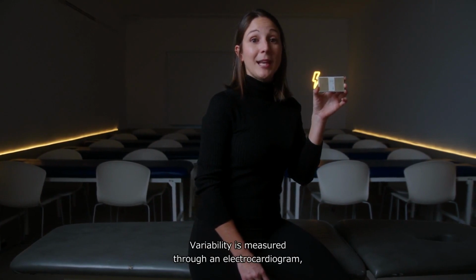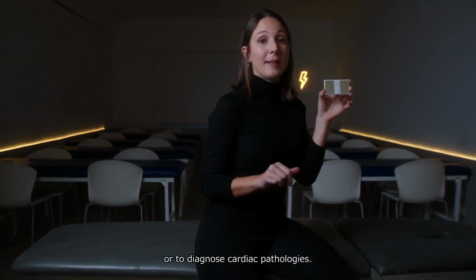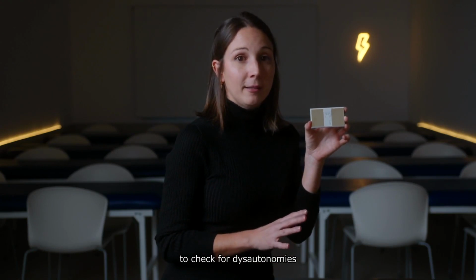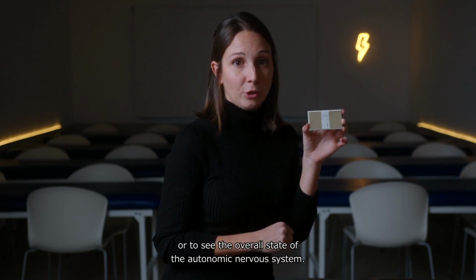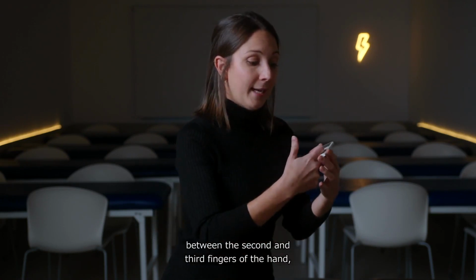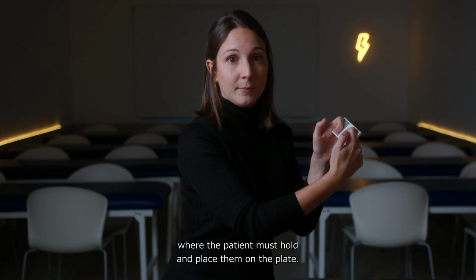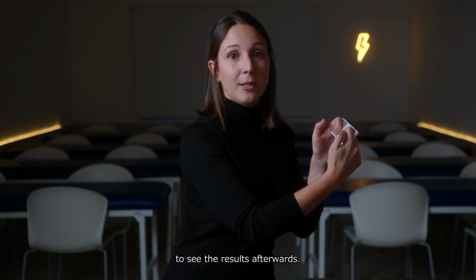Variability is measured through an electrocardiogram, but we must remember that it is not used to analyze or to diagnose cardiac pathologies. We will simply analyze cardiac variability to check for dysautonomies or to see the overall state of the autonomic nervous system. It should be remembered that this device must be placed between the second and third fingers of the hand, where the patient must hold and place them on the plate. Then we will carry out a 5-minute analysis to see the results afterwards.